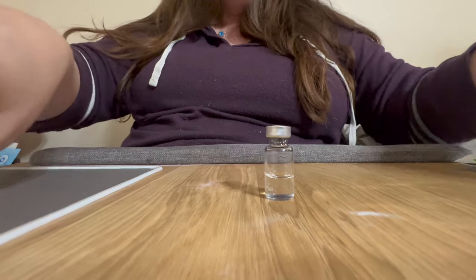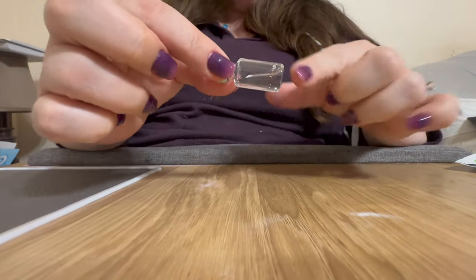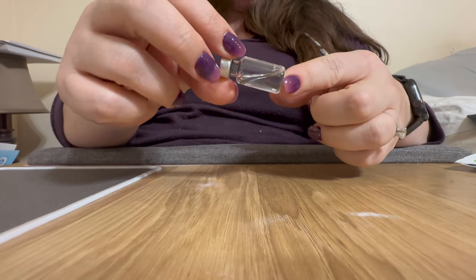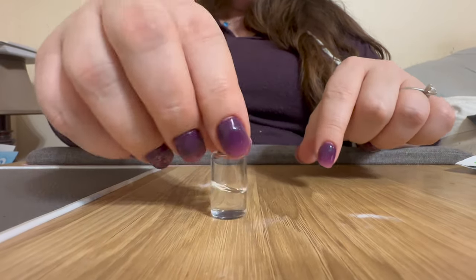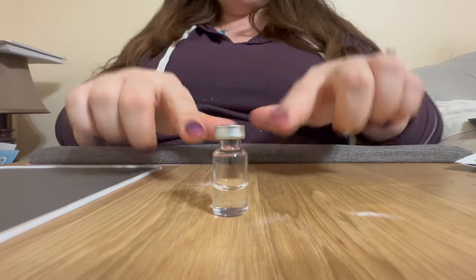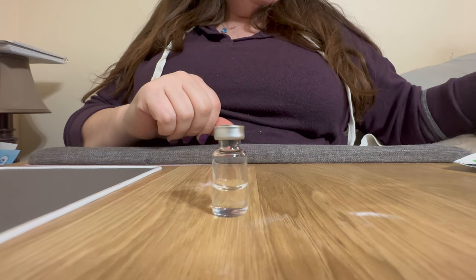Now you have your vial of Mounjaro and bacteriostatic water. There's 15 milligrams of Mounjaro in this, so every 0.5 milliliters I draw will be 5 milligrams.